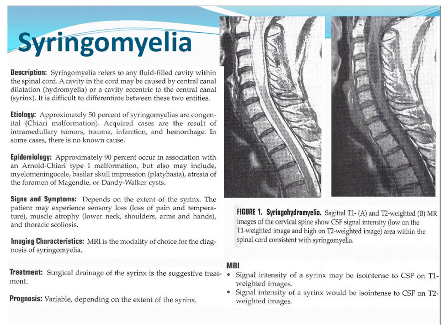So usually if a patient has known Chiari malformation, that being the most common etiology, they may want to do some cervical spine imaging, thoracic spine imaging, to see if they find the syringomyelia in the cord. And so I guess the one thing that you want to look out for if you see this on a study is, let's say the patient has been ordered just for a cervical study.